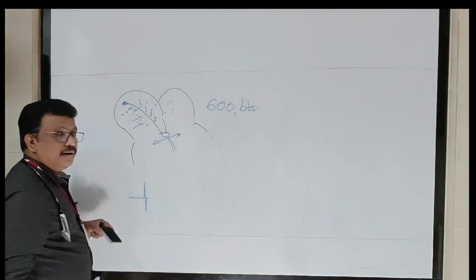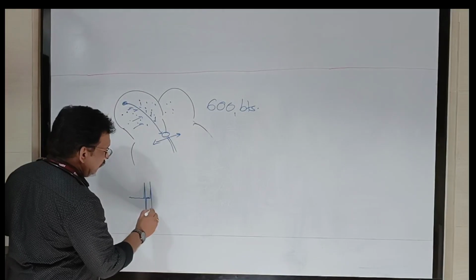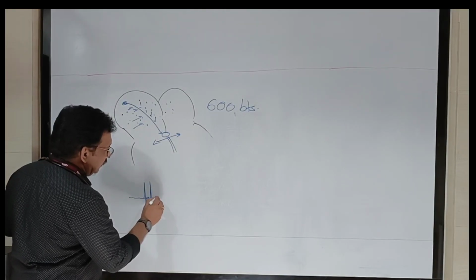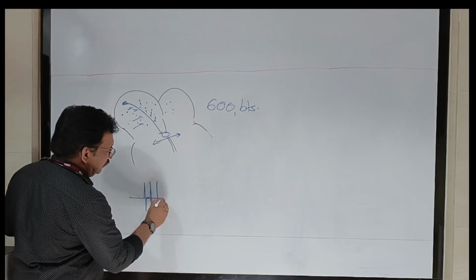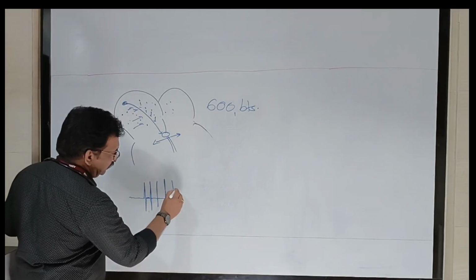And now one ventricular complex comes. Now again wavy baseline, another ventricular complex comes. Again wavy baseline, another ventricular complex, another complex. Now another complex.